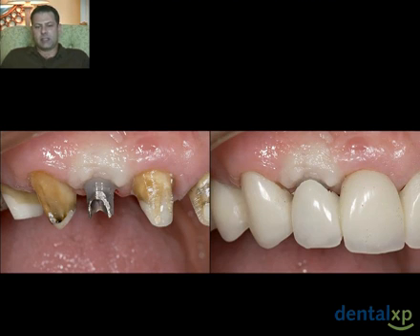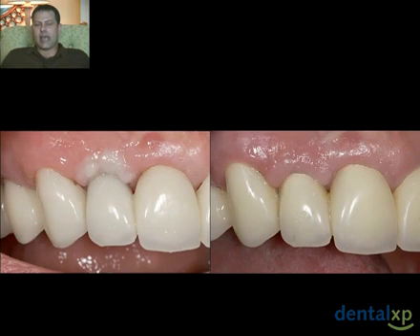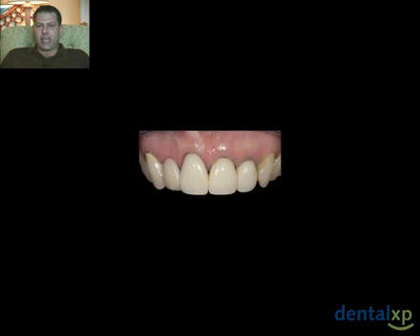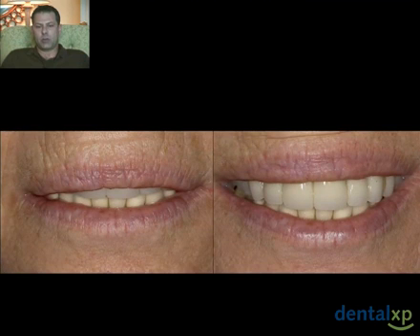So this is once I've put in the temporary abutment, I've relined my provisional, and now I'm going to be waiting till it heals. You can see how there's tissue blanching, and a week later you can see that the papilla are beginning to come down. Now, this is how the patient came in, and this is how we finished. And unfortunately, the patient wanted toilet bowl white teeth, but all in all, I think the contour of the soft tissue on the upper right lateral incisor came out fairly well, considering that this is 2 days after placement of that implant because the patient had to leave. So again, a predictable situation by virtue of looking at the bony contour.